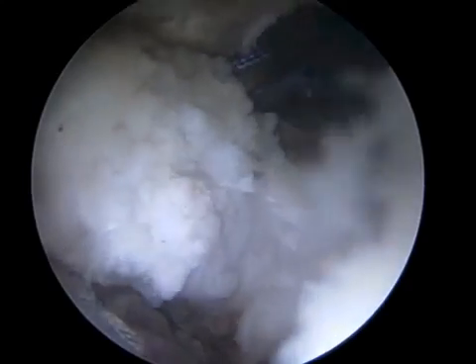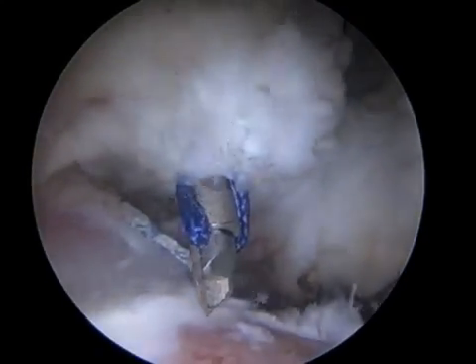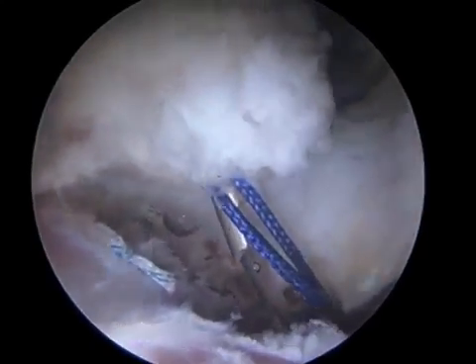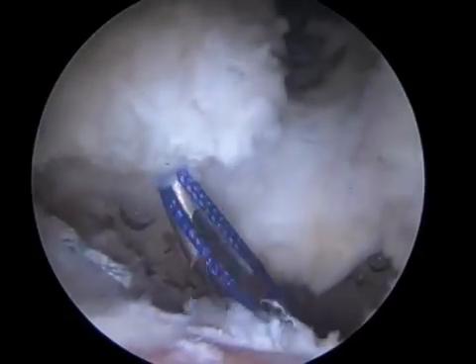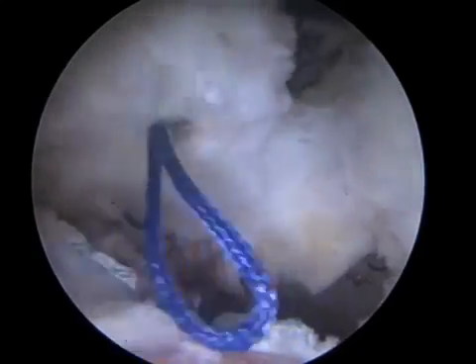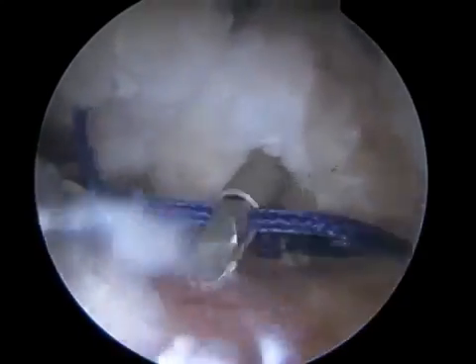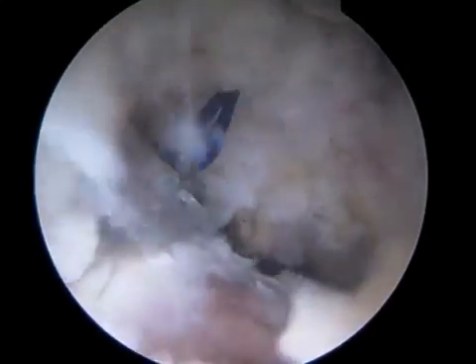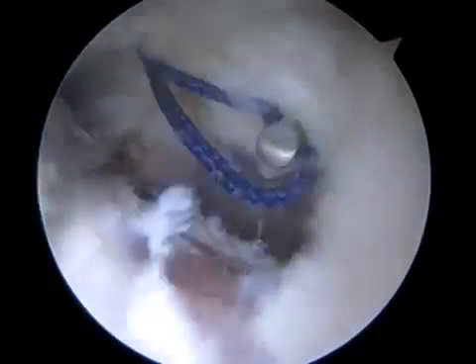This is a patient in whom I've already performed a labral repair and corrected her impingement. I have cut the iliofemoral ligament portion of the capsule and now will close it in a tighter manner by passing these sutures through it. They are passed through the capsule in a way that will tighten the capsule ultimately when they are tied. I typically will put three to four sutures in. In this patient, I am placing three sutures which I then tie on the backside of the capsule.